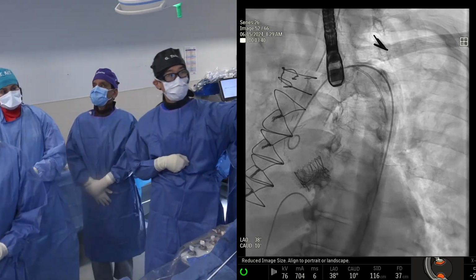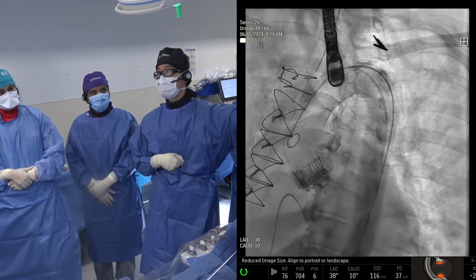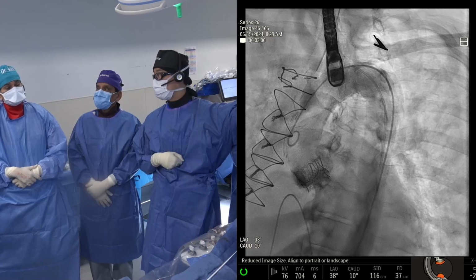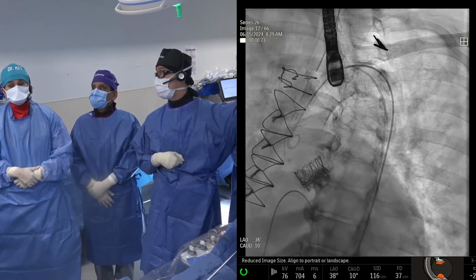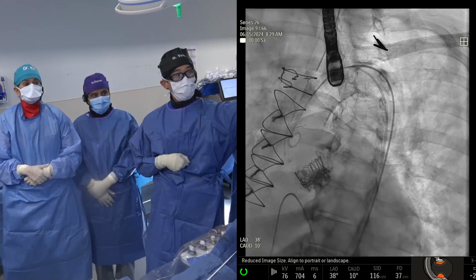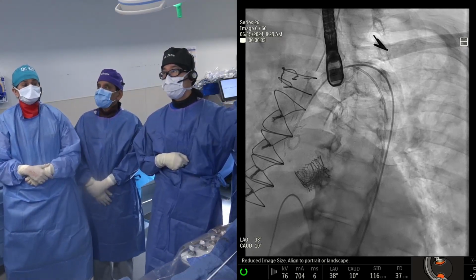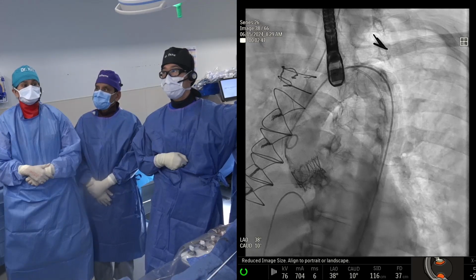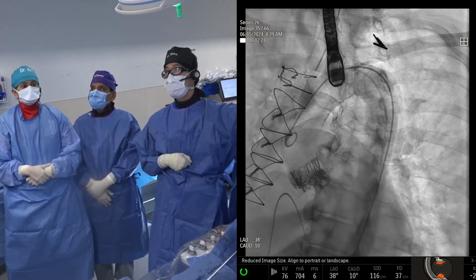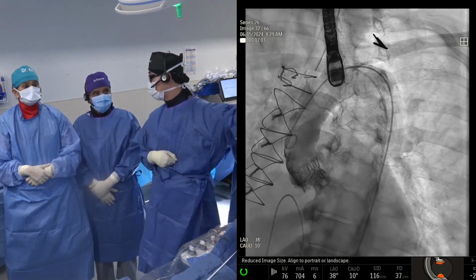You can see the top of the Sapien Resilia is at the top of the commissural post of the surgical valve. We plan it this way because, if you talk about TAV in TAV, your neoskirt is not going to be higher. Had you put this Sapien valve higher, your neoskirt would be higher. You can see the angulated band of the aorta towards the left main. So had you put a tall valve in, the first time it's going to be challenging. But even now, if you had put this one too high, you might box yourself out of the TAV in TAV option. That's by looking at the aortogram.